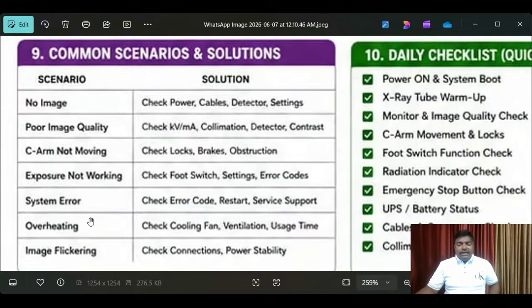See here, that's why in the operation theater a recommended AC is very important. Understand, for medical equipment, mostly radiology equipment, a specific 22 degrees is very important in that room. That's why proper AC in the operation theater is very, very important, because without proper AC the equipment overheats, and then there are many chances of damage to the inside components.